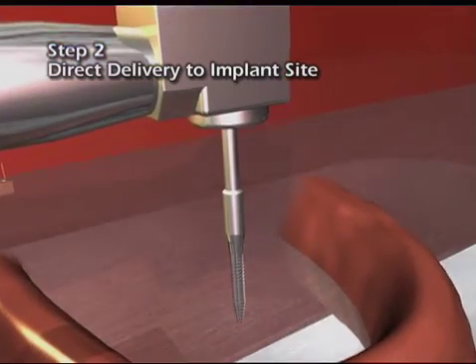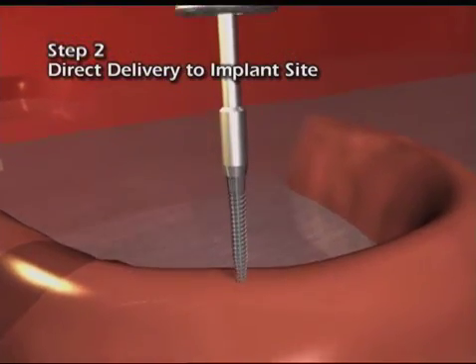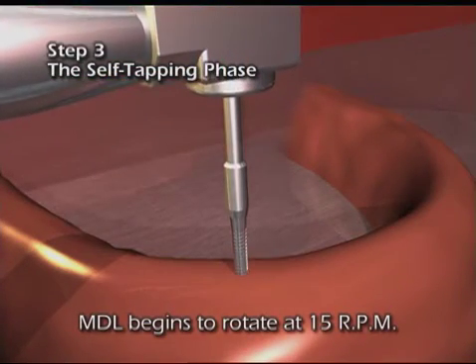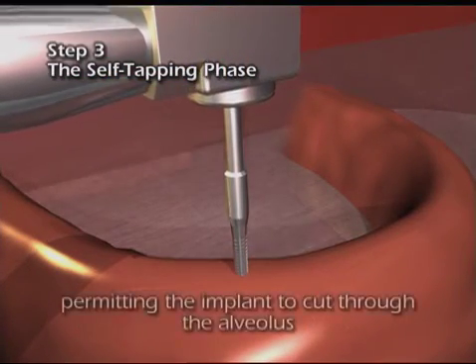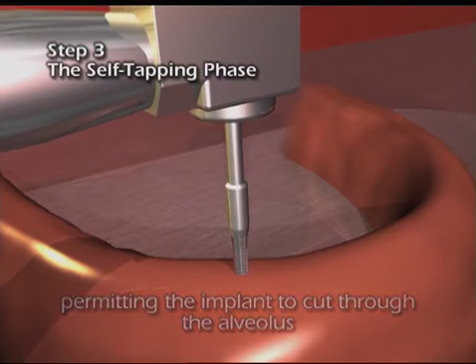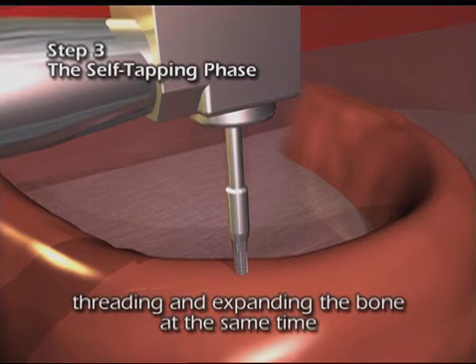The MDL's sharp apical guiding point initiates the self-tapping action as the implant begins to rotate at approximately 15 rpm, permitting it to cut through the alveolus, threading and expanding the bone at the same time.